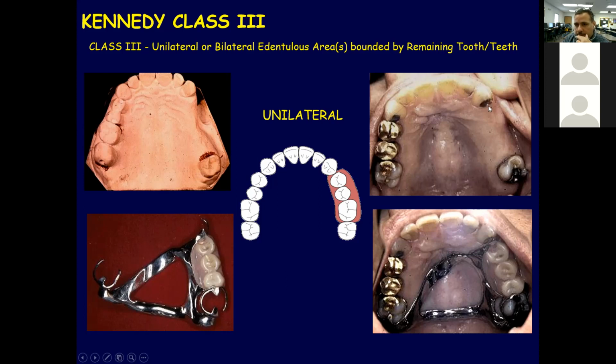This is a canine. So sometimes the dentist will make a little dent. They call it a seat, or rest seat. Sometimes the dentist will make this. We don't do it. The dentist will do it, not the dental technician. So they make a dent, and sometimes they fill it with metal or amalgam, silver filling, or sometimes a crown, like these crowns.